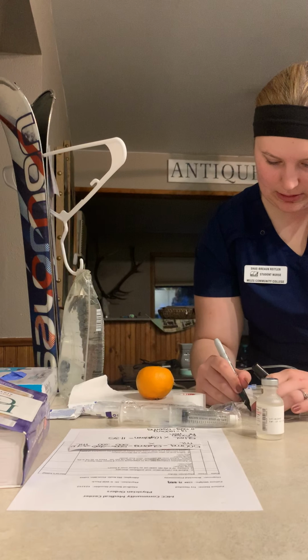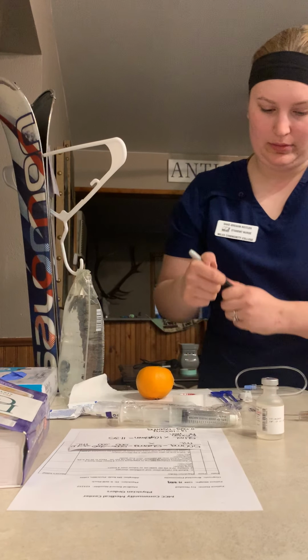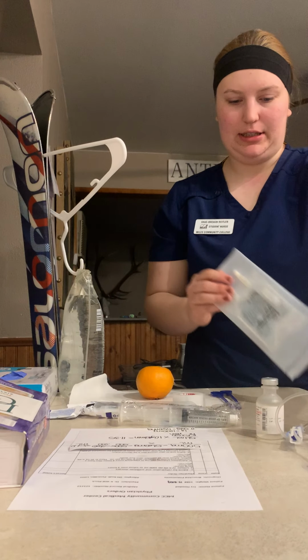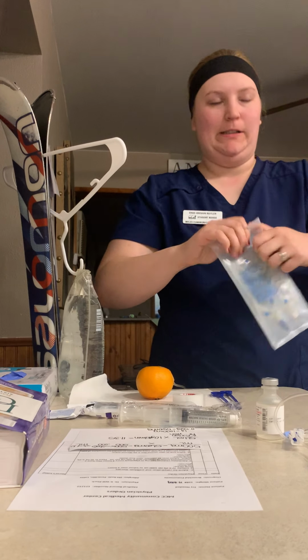With date, time, and initials. Okay, I'll put this aside for a second, and I'm gonna open this one. I might need scissors.